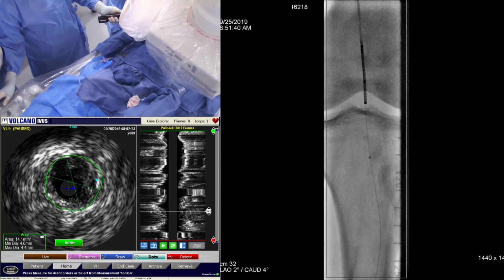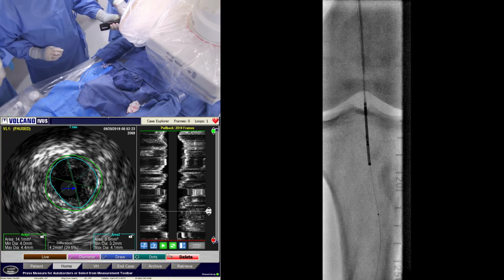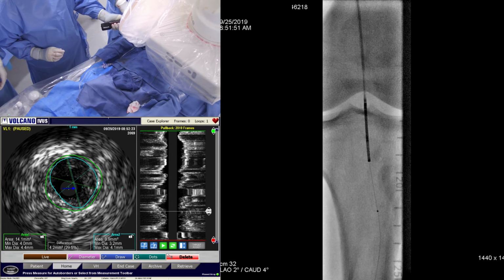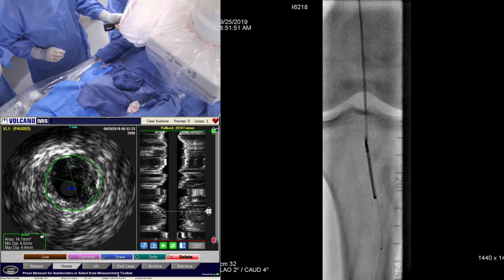So I'm going to try not to stent this one, please. So I'm just going to go ahead and do a little atherectomy. Off, please. And not yet. I'm just going to go a little bit further down, and then try to use a 4.0 DCB to give some medication to this. On. I undersized my atherectomy on purpose.